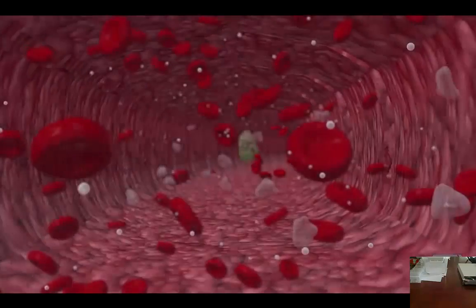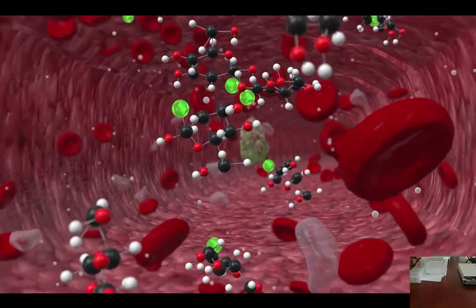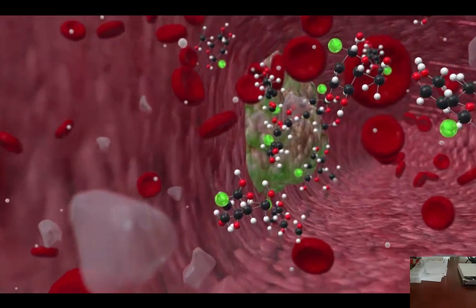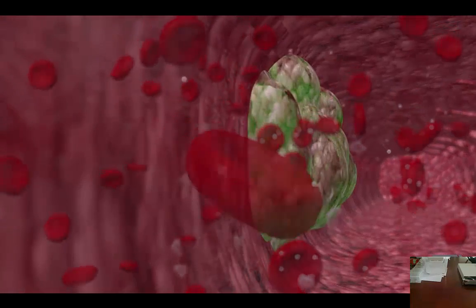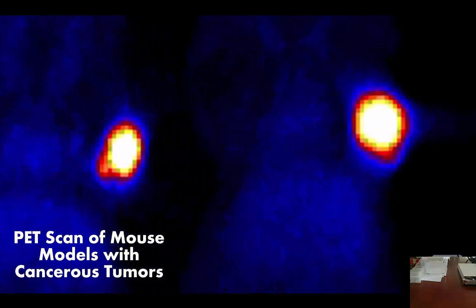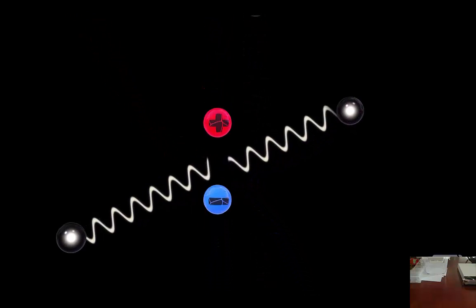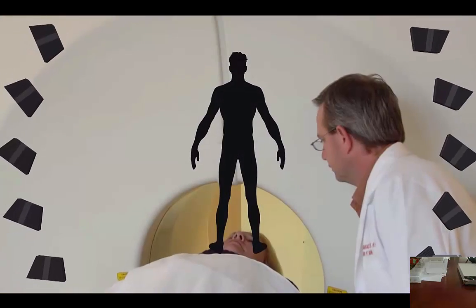If she suspects cancer or is monitoring a known cancer's growth, she may use FDG, a modified form of glucose, which gets absorbed by tissues. When tissues absorb a lot of glucose, it may indicate a cancerous tumor. The radiation from the tracers poses little danger to the patient since they quickly pass out of the body. The isotope produces small particles called positrons, which interact with surrounding electrons. This interaction results in the complete annihilation of both particles, releasing two photons that speed off in opposite directions.